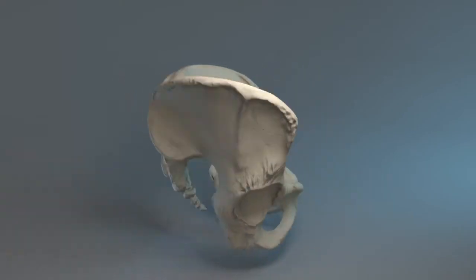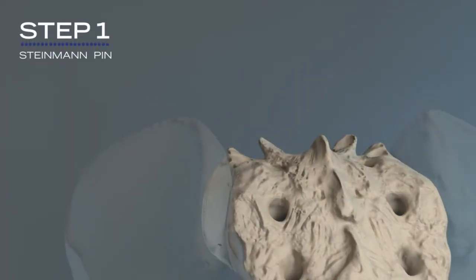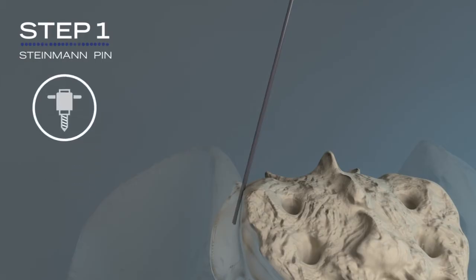First, the Steinman pin is inserted into the SI joint between the sacrum and the ilium. There is no drilling involved.